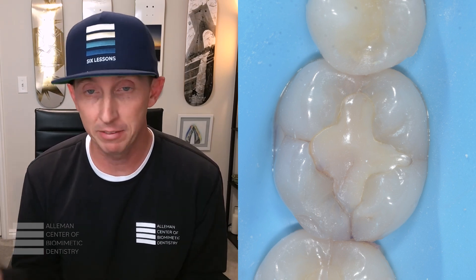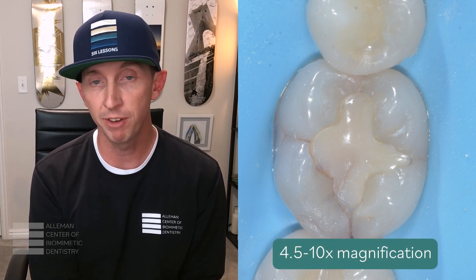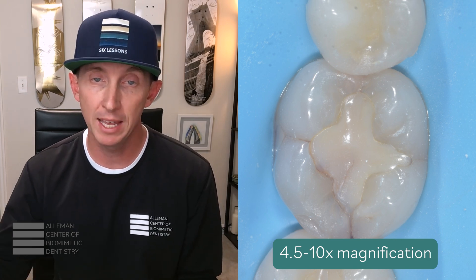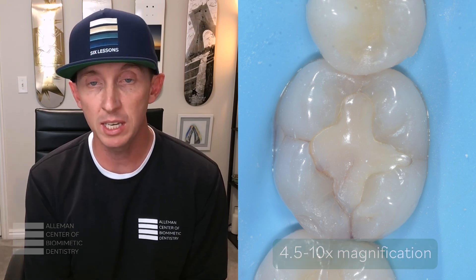Now, the second thing that can go wrong is not even seeing it. If you're not using high enough magnification, we highly recommend that you use at least 4.5x up to 10x so you can see the fractures and particularly help you when you're treating them.